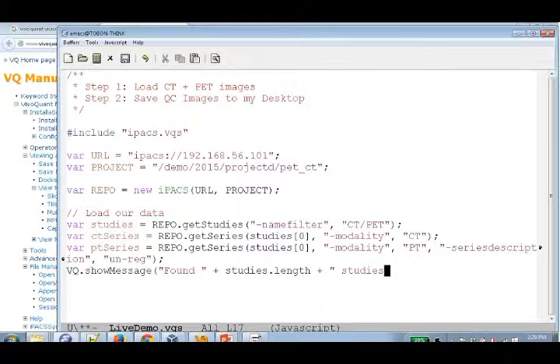At least from what I've heard from my teammates, it's easier to learn JavaScript than it is to learn MATLAB, so maybe that'll be the case for you guys. Yeah, I learned it, so it must be easy.